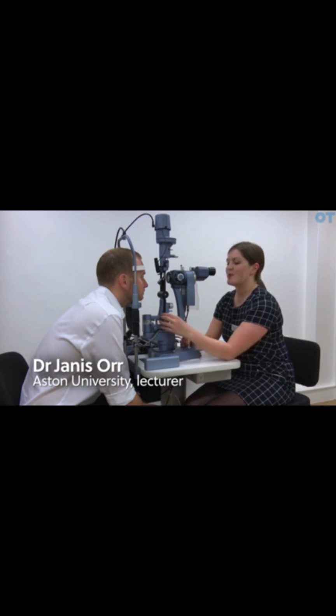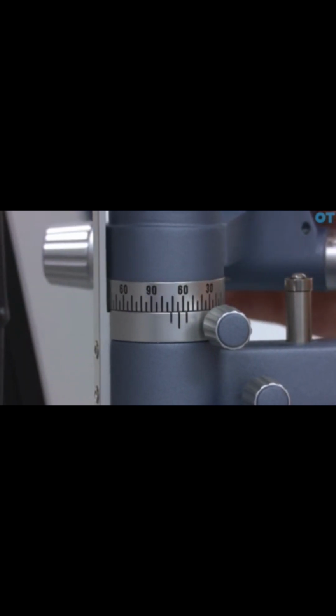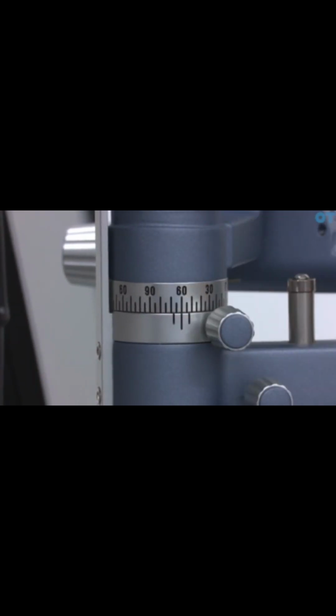So one method that allows you to check the depth of the anterior chamber is Van Herrick's technique. In order to perform Van Herrick's, the observation and illumination systems have to be separated by exactly 60 degrees and locked into place.